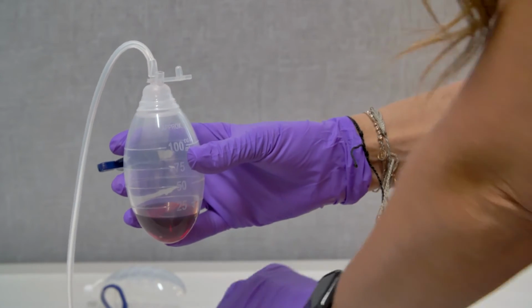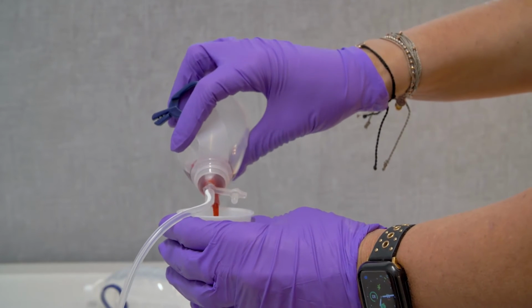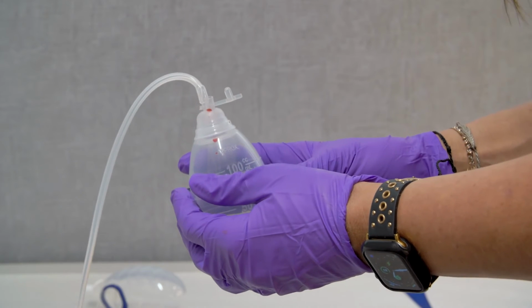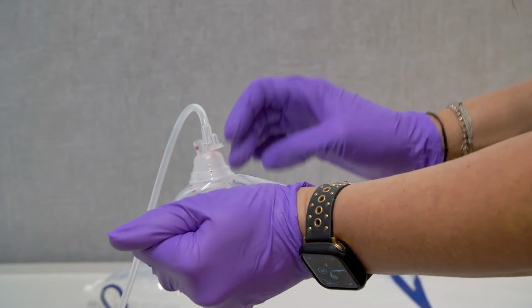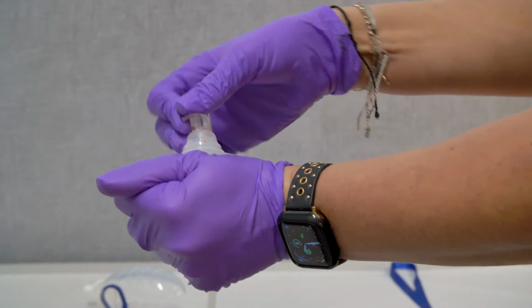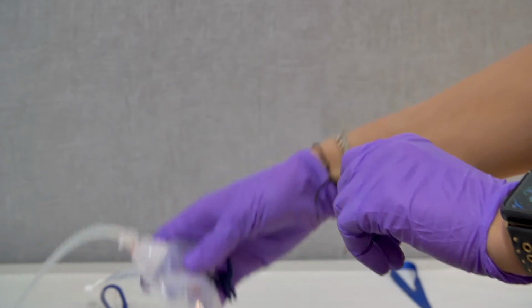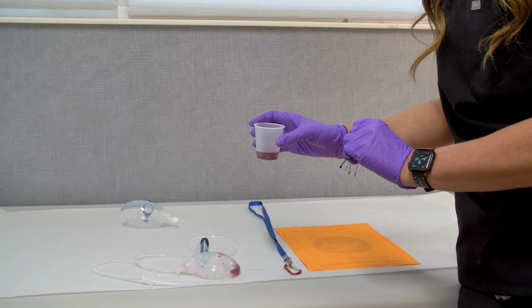You do want to then take the cup that has been provided for you. You want to empty the drainage into the cup. Then, these drains work on suction, so you do want to make sure that you squeeze the drain back together to engage that suction and then place the flap back into the holder. Once again, you do want to make sure that it is squeezed together like that because that is engaging the suction. You will then go ahead and take the drainage and pour this down the toilet.